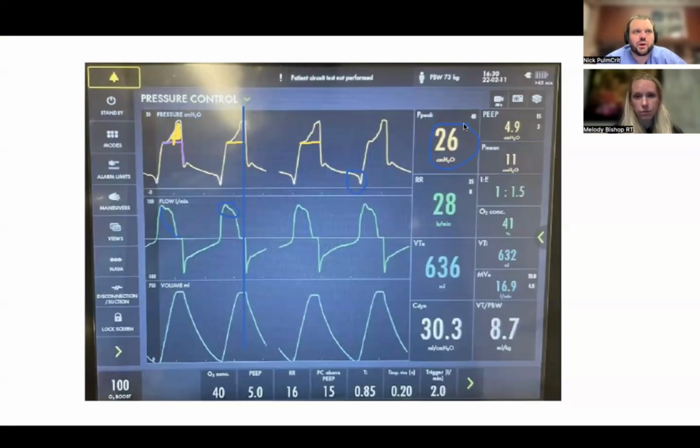There's a lot more nuance you have to be aware of if they're in pressure support. And I don't know about you, but for some reason there's this very ingrained thought that when the patient's in pressure support, oh, are we extubating? I'm like, no, they're just in pressure support. They can breathe at their own pace and control more. And no one can seem to really grasp that the patient could be in pressure support as a mode, it doesn't have to be PC or PRVC or whatever.